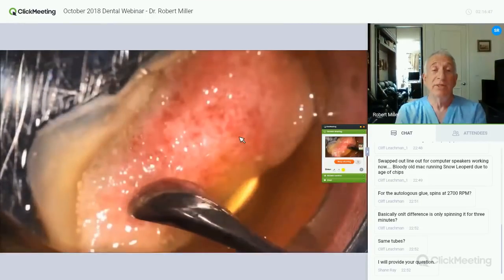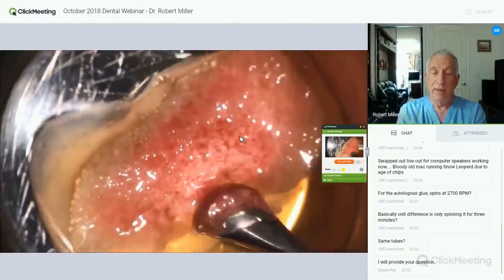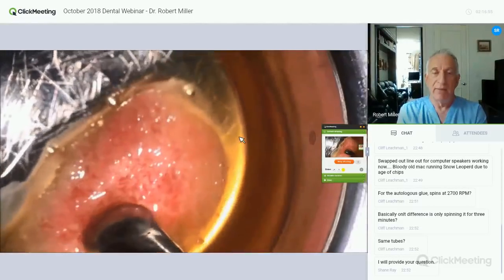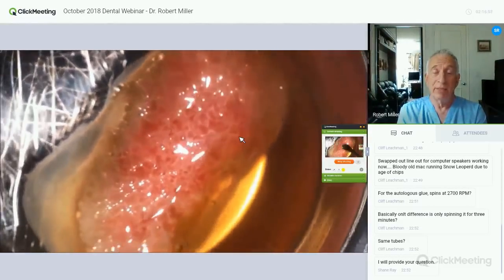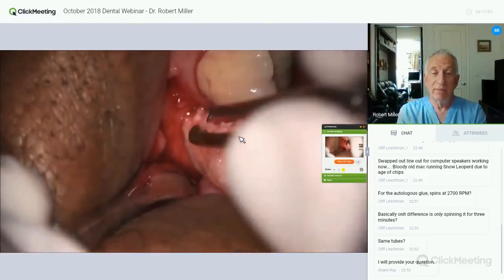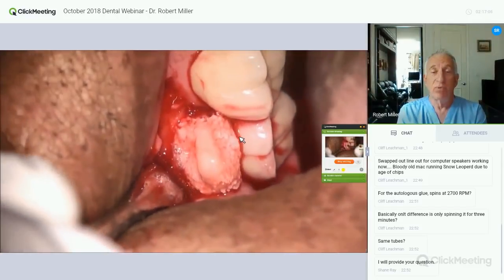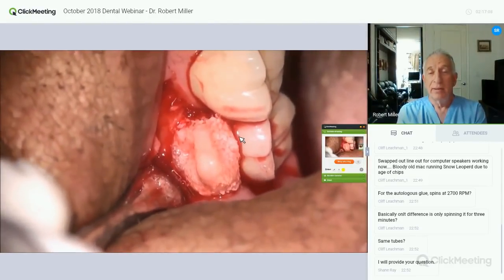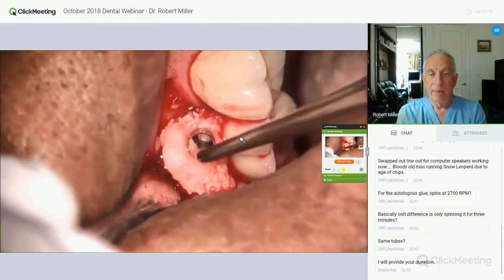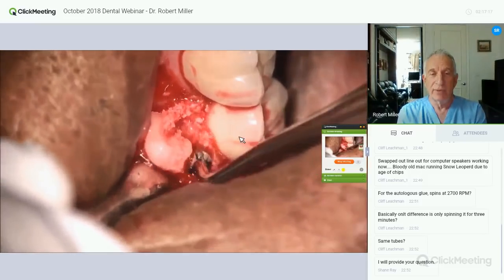And then we're going to take our bone graft. Now this is not osteoid, this is actually normal Cerasorb M, beta TCP. I've used a little bit of autologous plasma. After 20 minutes, it becomes a hardened mass. Now it's easy to take one of these pieces of bone graft material, bring it right into the site, and then just go ahead and compress it right down into the defect. It packs just like any collagen would. It's amazing. It handles so beautifully.